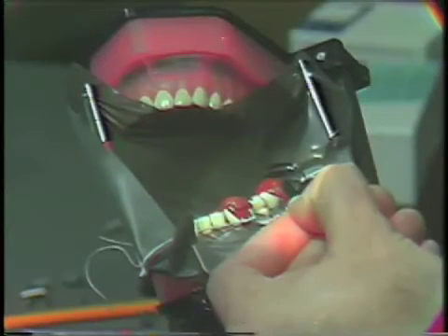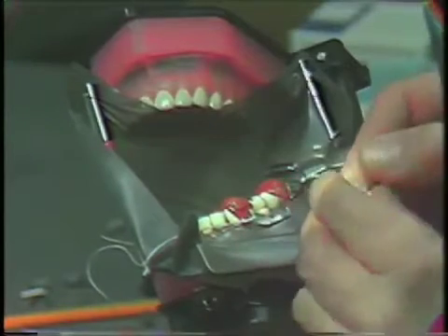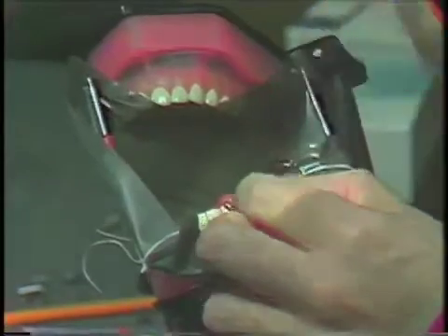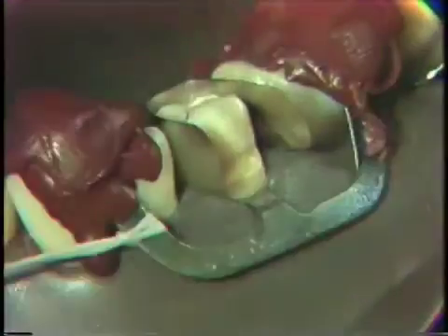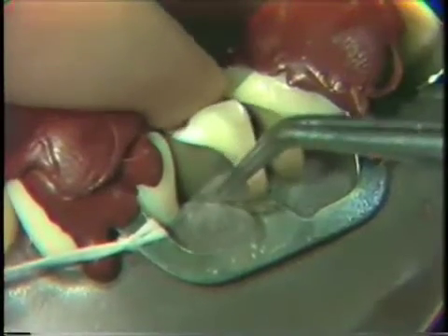Now with our matrix fully trimmed on both ends, we can now insert it around the tooth. And if we've trimmed appropriately, we should have enough of the matrix extending out buccally so that we can contour appropriately in the interdental area.